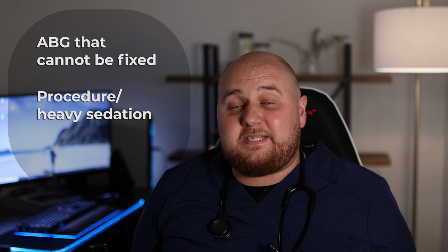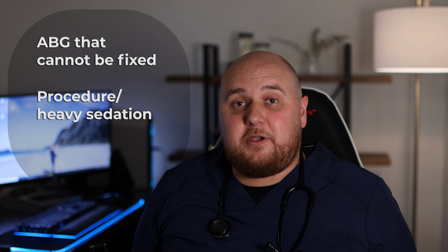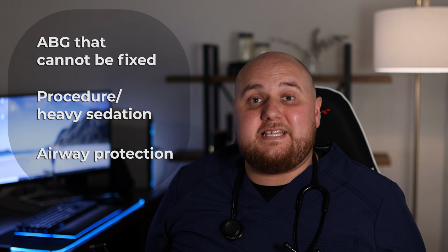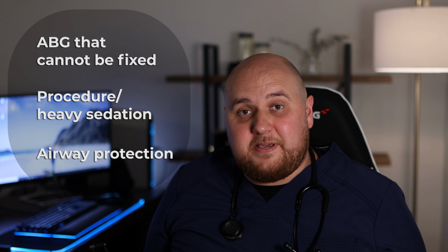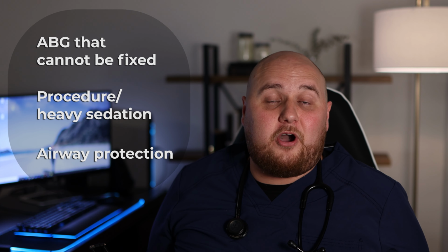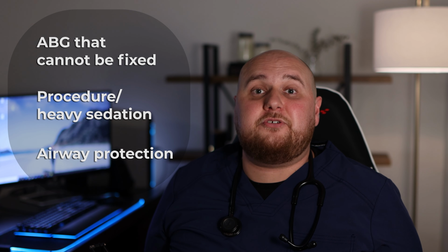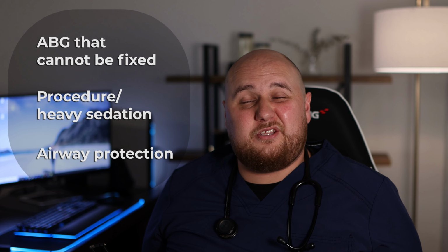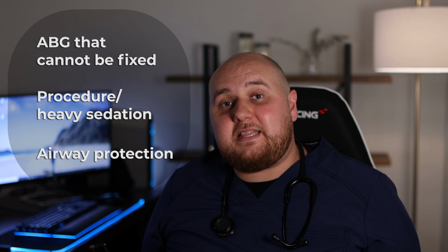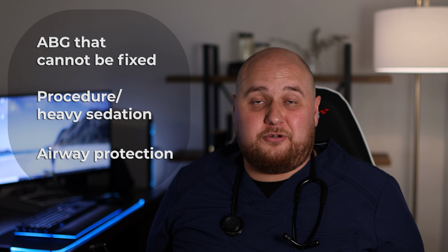Another very common reason why somebody might have an endotracheal tube and they'll need a vent being placed on them is airway protection. Now, airway protection is something that's a little bit more subjective in terms of when a person needs to get an endotracheal tube or get intubated. And airway protection is going to go along with if the RT, the MD, or the RN thinks the patient can't clear their secretions, they can't cough safely, or they're not able to protect their airway, and they're going to eventually either choke or something else is going to happen that the person might risk their life. So it's better to prevent that, and until we fix that problem, they're going to have some kind of artificial airway where we can control their ventilation.